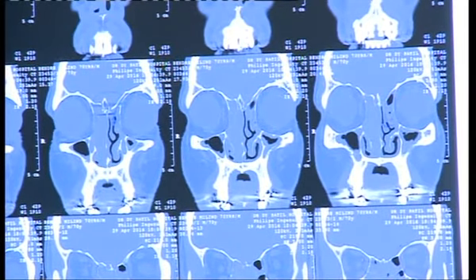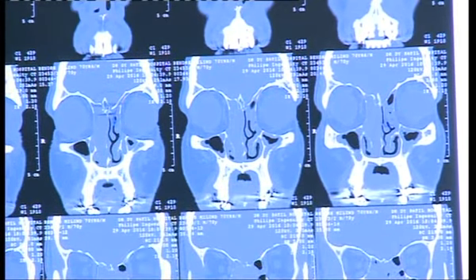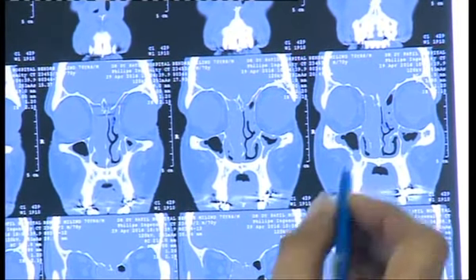This is where the anterior ethmoidal, a branch of the ophthalmic, leaves the orbit. So we can't see. The camera has to move. It leaves the orbit between these two muscles, the superior oblique above and the medial rectus below.